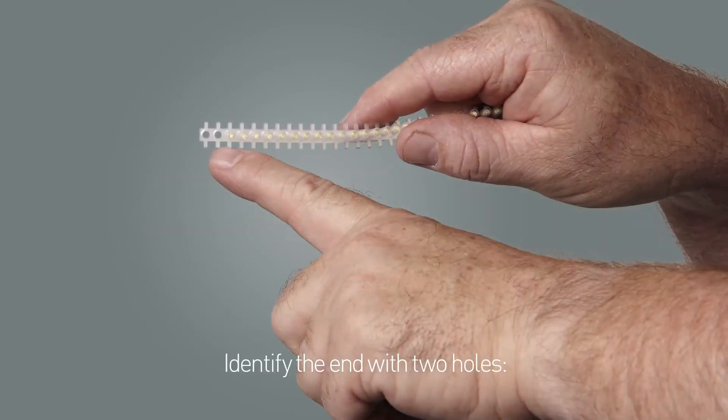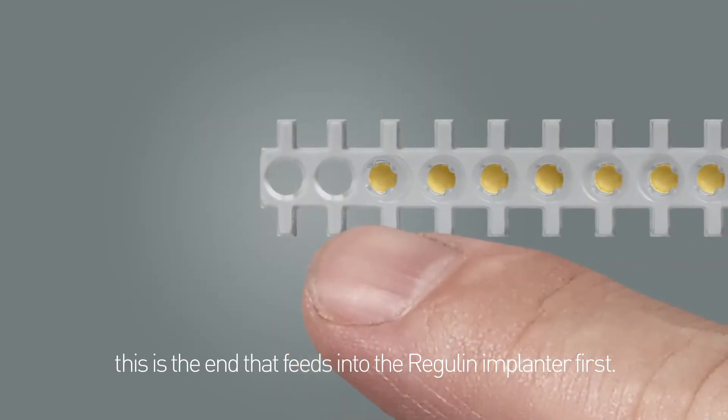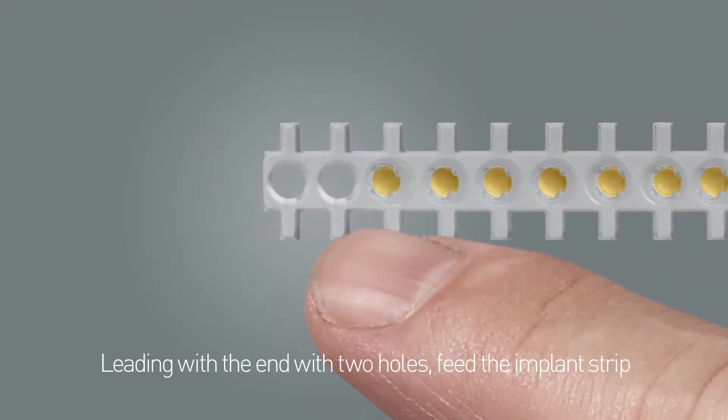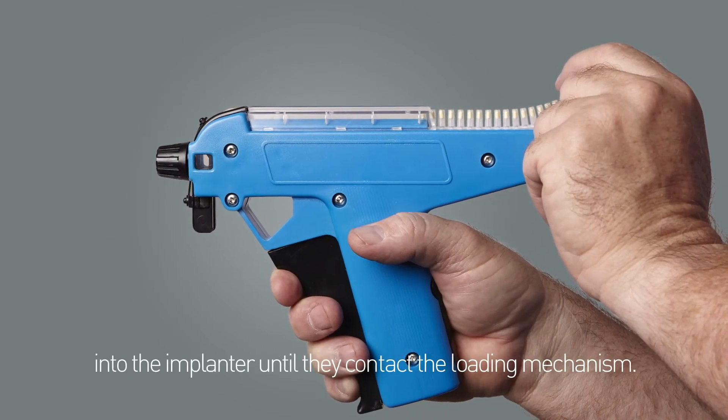Identify the end with two holes — this is the end that feeds into the Regulin Implanter first. Leading with the end with two holes, feed the implant strip into the implanter until they contact the loading mechanism.